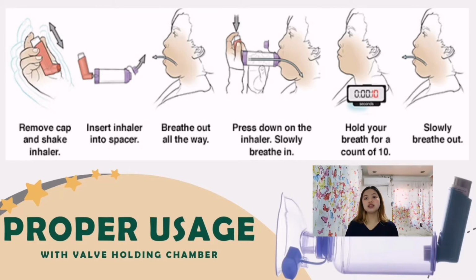Lastly, breathe out slowly. Repeat the steps above for each puff your doctor has authorized, and take note that you need to wait a minute before each puff. When you are done, place the cap back on your MDI.